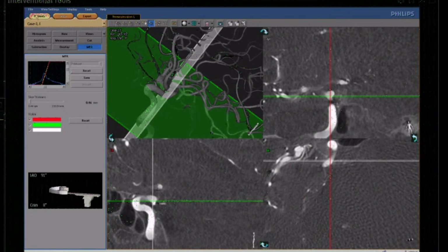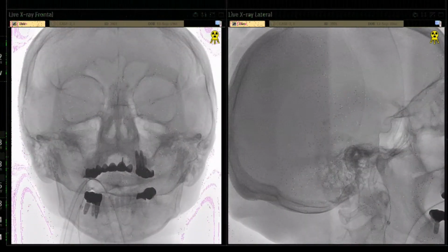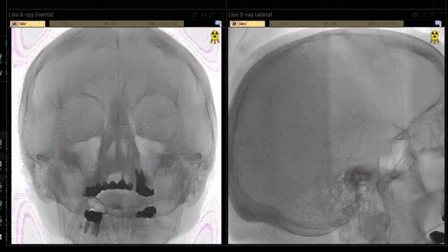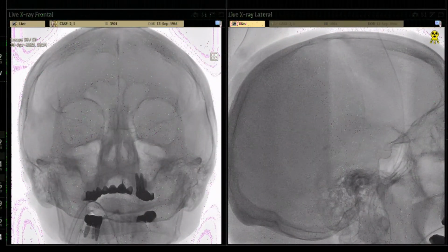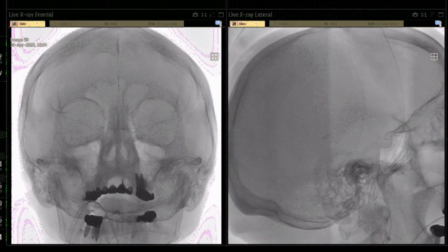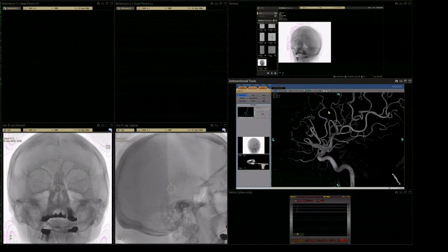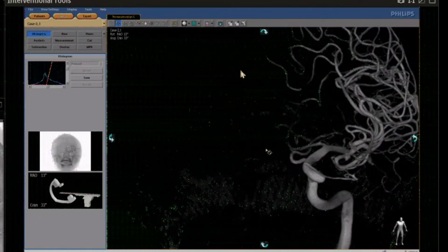можно пока это убрать на review. I need to see the right side. Just a second. Left side. Теперь можно опять на КТ. Yes, because of some names on the screen.